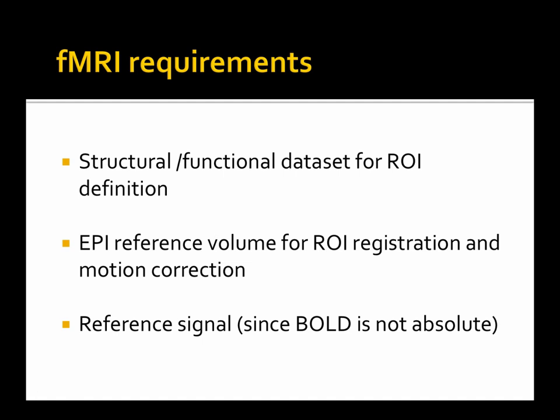That has a trade-off, because you want to train your subject for as long as possible, but the longer you are in, the more likely the subject has moved, and the registrations may have some issues as well. And while you cannot verify everything online, you can always check how much each of these things would affect your data as you go by.